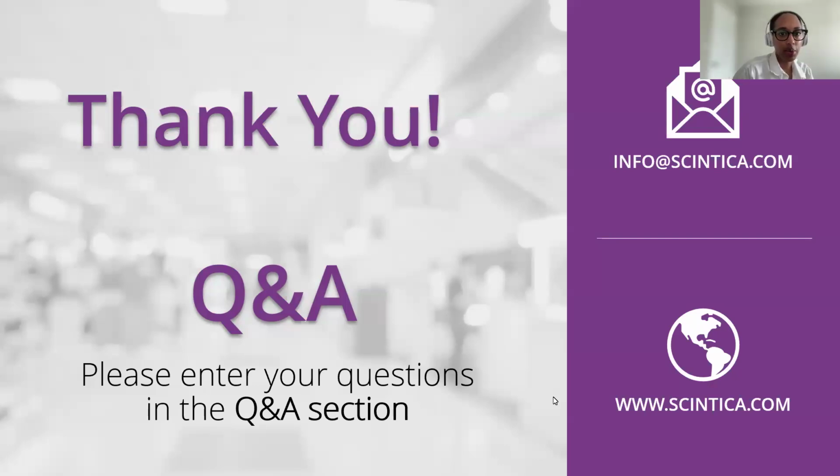And what is the downtime processing multiple mice? So how long does it take to switch from one mouse to the next? I guess it depends. The more you do it, the easier it gets, I will say. For me, it's pretty quick. I prefer to anesthetize the next animal while the first animal is being imaged. That really helps decrease the amount of time that it takes to pull the animal out and make those adjustments. But it's fairly quick.